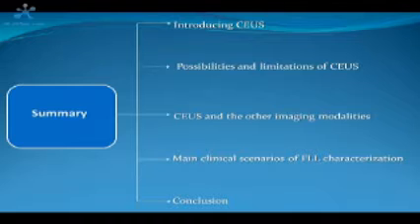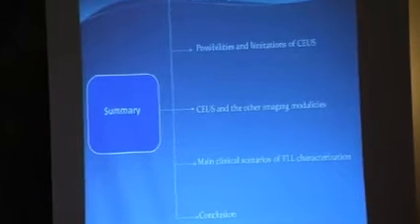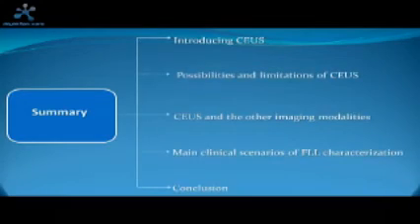My presentation will deal with the CEUS. So in this less than half an hour, I will try to introduce you, particularly for those people coming from countries where CEUS is not available, to CEUS and to discuss the possibilities and limitations of this not so new, but rather new imaging modality.